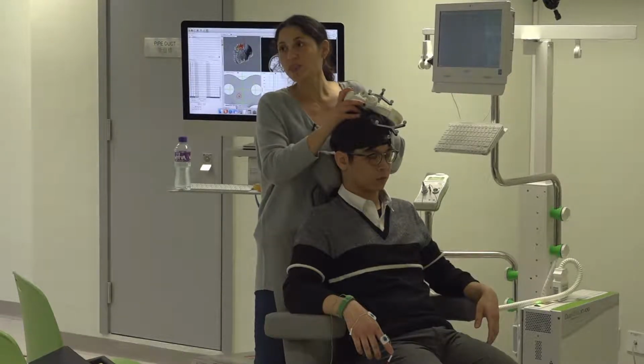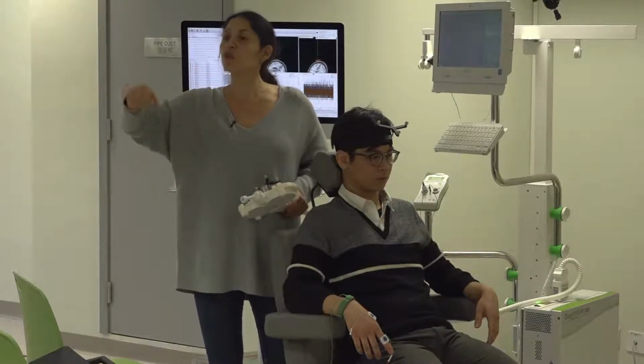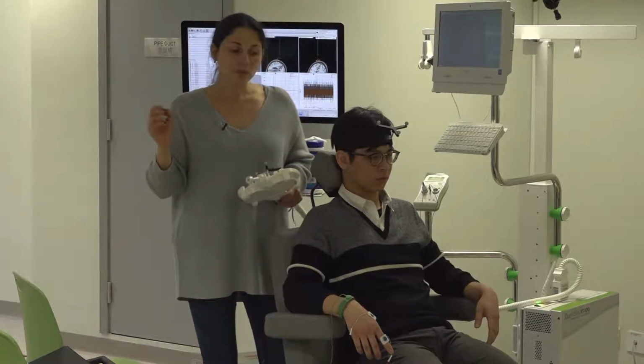And I'm trying to get a stable point, right? But if I'm getting one finger and then 2, no, and then one again, and then 2, no, so it's not the hotspot. It should be stable. So what I did, I found the stimulation before when 2 fingers were moving. So I reduced the stimulation level, because probably I'm overstimulating now.